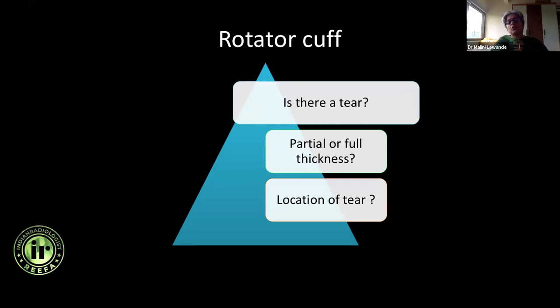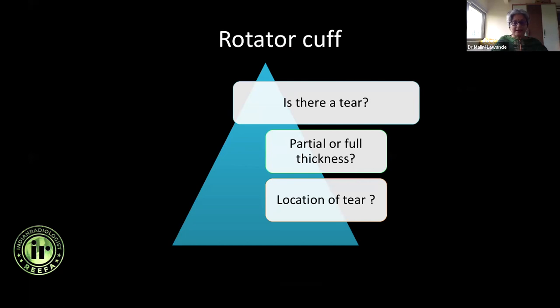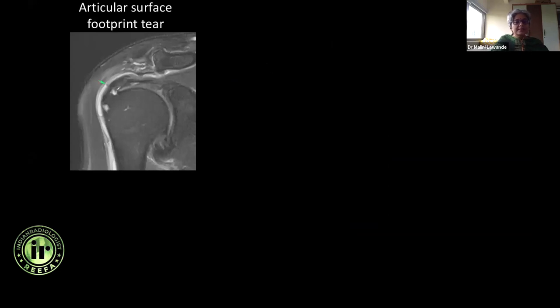Now, suppose you decide it is a tear — what are the things you want to address? Is it a partial thickness tear or a full thickness tear? And what is the location? Is the tear along the articular surface? Look at this area — the bursal surface fibers are intact, the articular surface fibers are torn, and this is at the footprint. It's not enough to say there's a tear or that it's an articular surface or footprint tear — what's important is how severe the tear is.